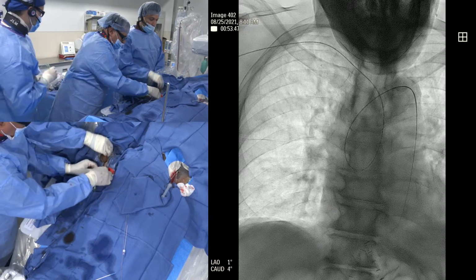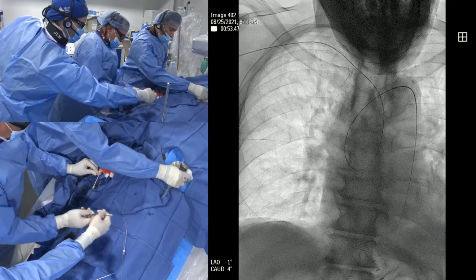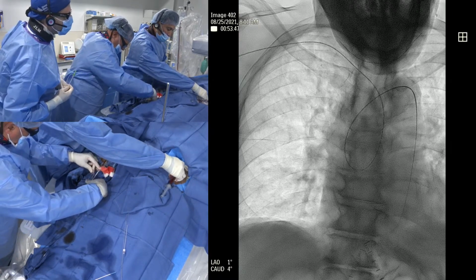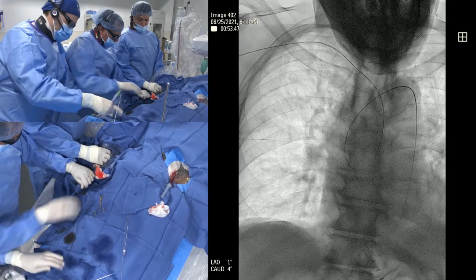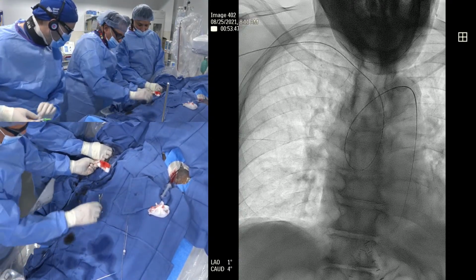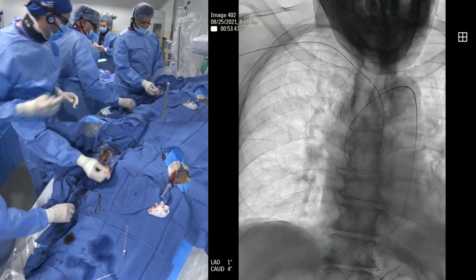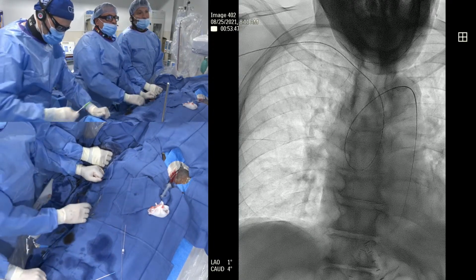I need a scissor, guys. Okay, give me the sheet now. What is this? Hold on, glide wire, right? Probably just stuck to it. Hold on, it's a catheter. Let's just make sure our wire is still there. Wire is good. Wire is still there.